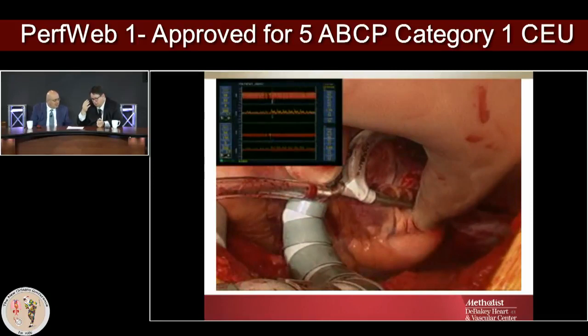Well, we alerted the surgeon, and after that we really went through a bunch of different testing: the angle of the CO2 blower, what can we do? And I really like the idea to fill up the cavity with CO2 to try to get rid of the air that way. So I think we do learn those protections, what's the best technique.